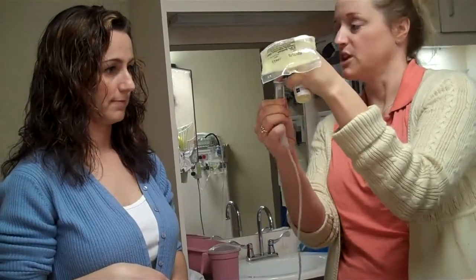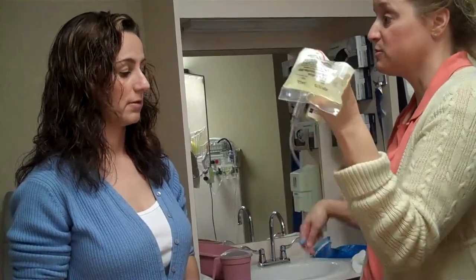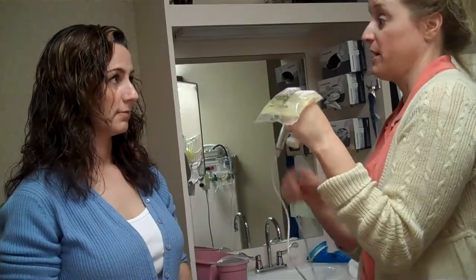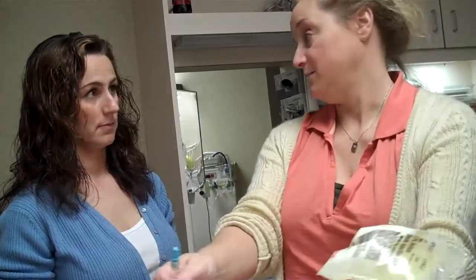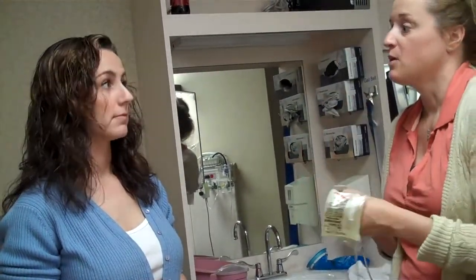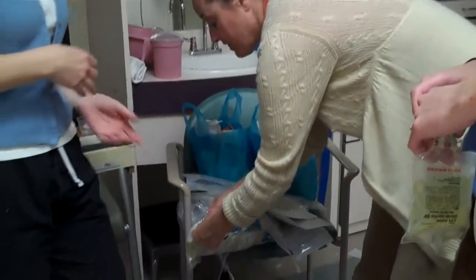You'll squeeze your chamber so it's half full of fluid. Then you'll go to the sink and you'll open your clamp and make sure fluid comes out, and the tubing fills full of fluid. Not a lot. There's a little extra built into each dose because they know we have to prime. It's called priming the tubing. So when it comes out the other end, this is ready to be hooked up to him. So I always get the infusions ready. With the gentamicin, if you look at the bags, it's going to be the same thing.